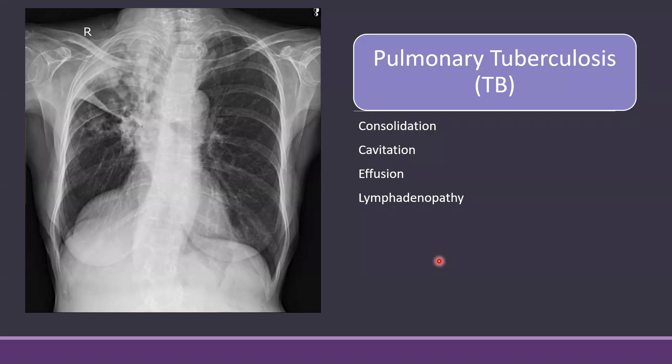Hi, I am Dr. Zubair and today we will be discussing an important x-ray — a common x-ray which we usually see in our practice — and that is an x-ray of pulmonary tuberculosis. As you know, it is quite common in some countries like Pakistan and India and has got high prevalence. In fact, TB can present in various ways on a chest x-ray.